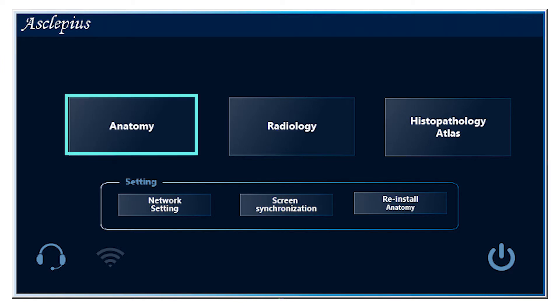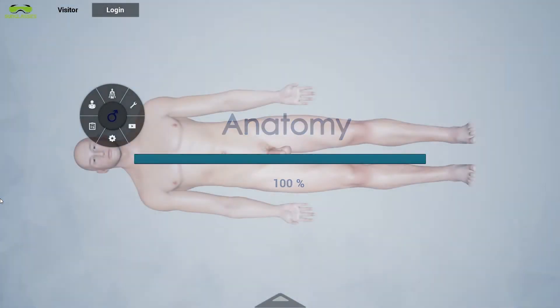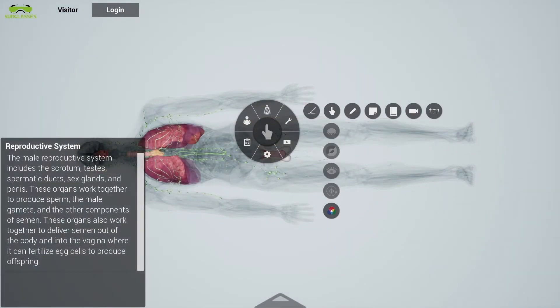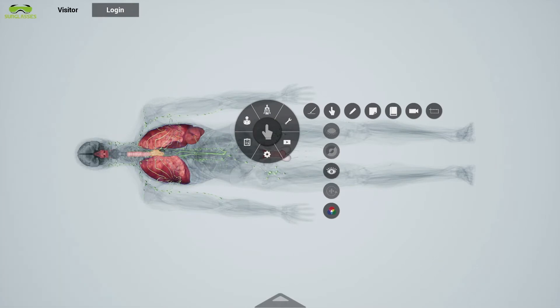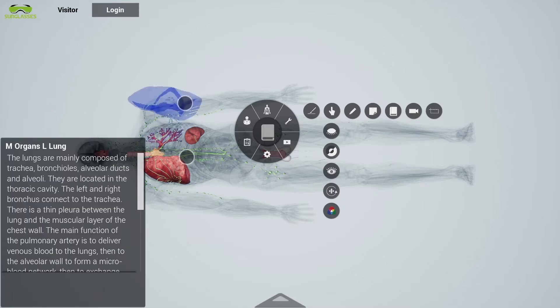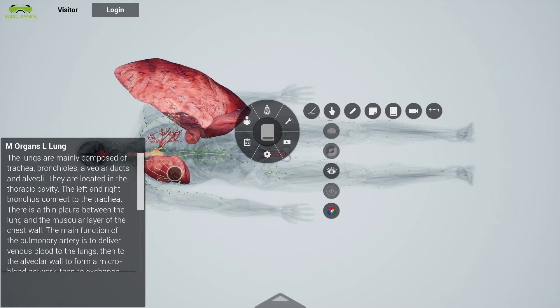The anatomy part consists of two virtual human cadavers, one male and one female. Asclepius turns out to be the best teaching aid for professors, as they can go layer by layer inside the virtual human cadaver or perform the virtual dissection.